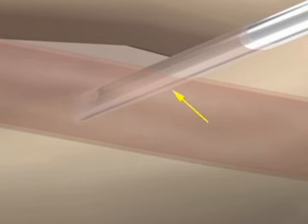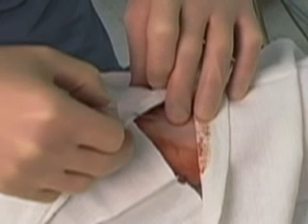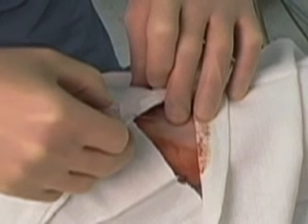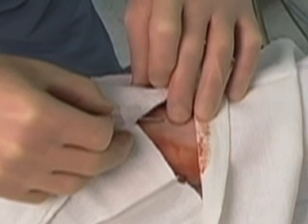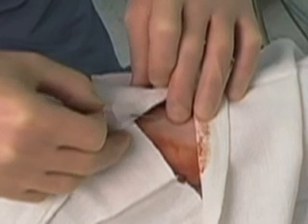By advancing the needle slightly farther after the initial flash of blood, the catheter can enter the artery, allowing for successful cannulation. In some instances, the catheter may get hung up on the skin, making it hard to advance. The risk of this can be minimized at the start of the procedure by making a skin nick using either an 11-blade scalpel or a larger bore needle.